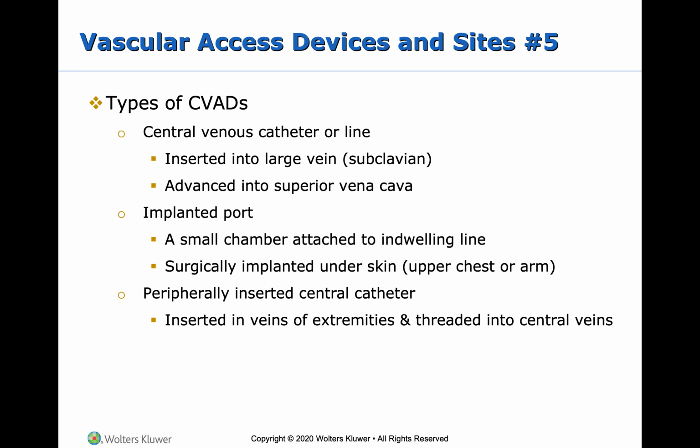You're going to want to do a discard tube of at least 5 milliliters. So give them a 5 milliliter syringe if they need it. Most of them will just use the syringe that they flushed the line with. They're going to pull blood back 5 milliliters, 5 to 10, whatever they prefer, at least 5 though. You're going to take that syringe and throw it in the sharps container, but you're going to throw it so that the plunger is sticking up, because if you put the syringe in plunger down, it's going to hit the bottom and the blood can actually squirt out of the sharps container. So make sure that you're putting it in with the plunger up.